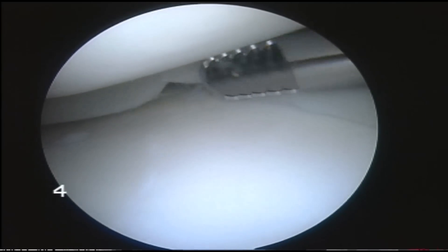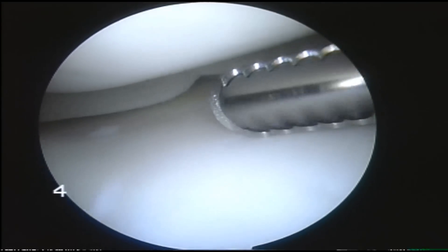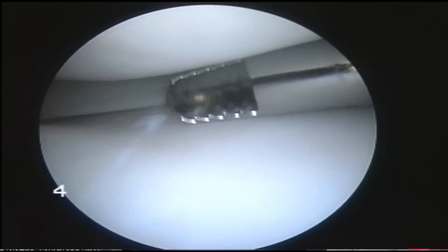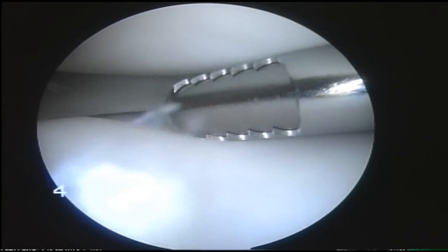Put the suction on and pull out any loose bodies that are hiding, either under the meniscus at the back of the knee joint or stuck to the articular cartilage itself, like that one.